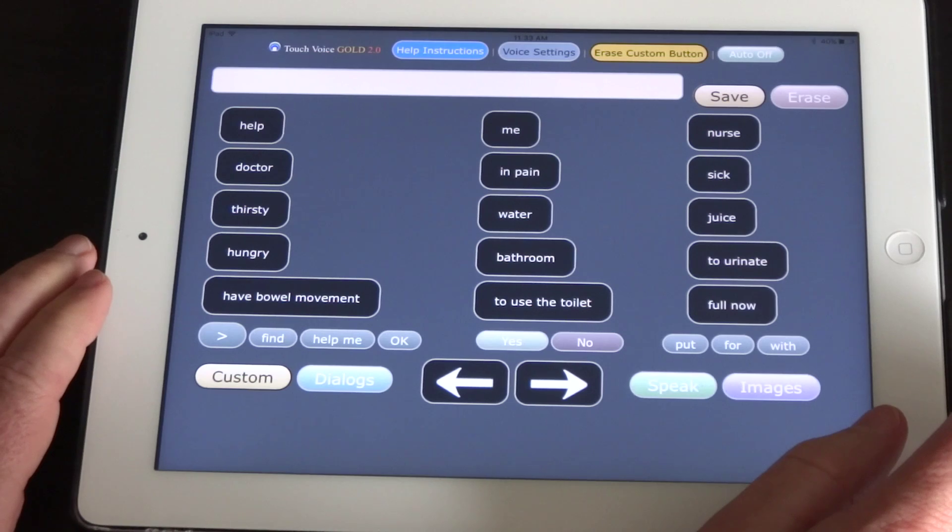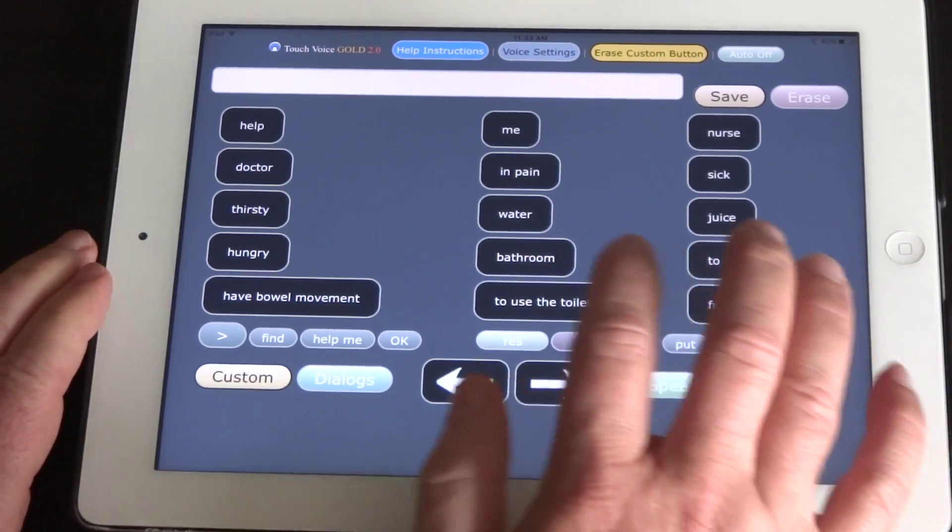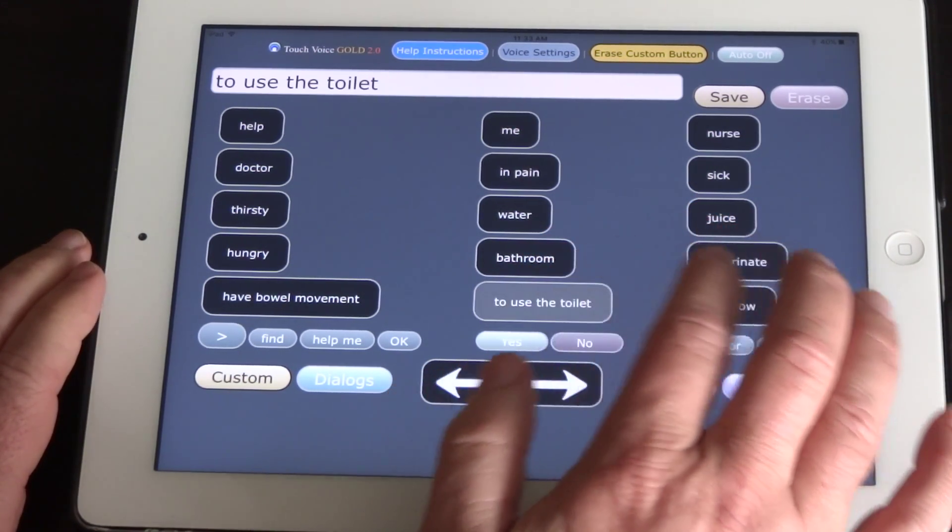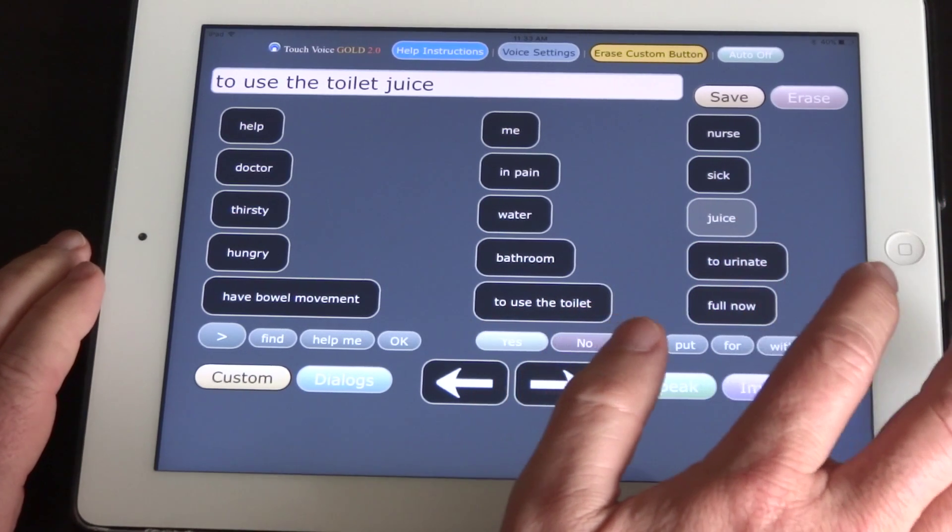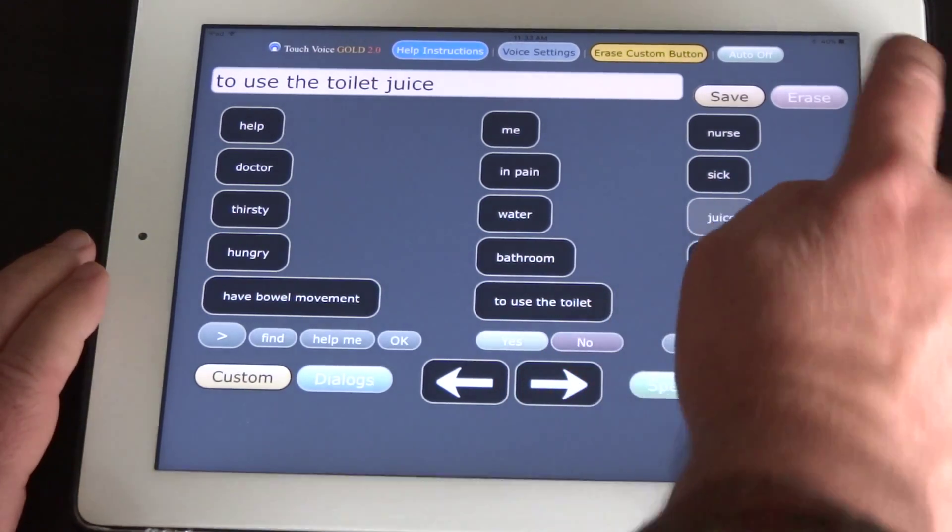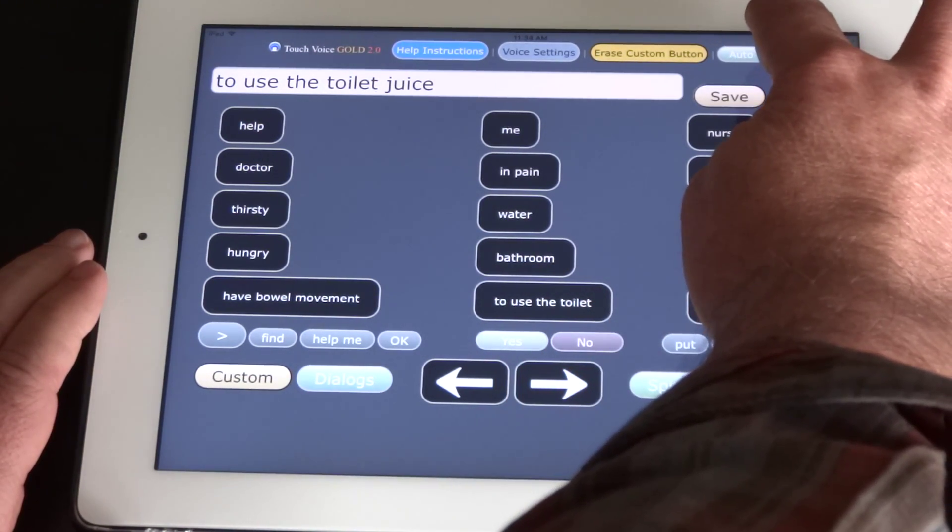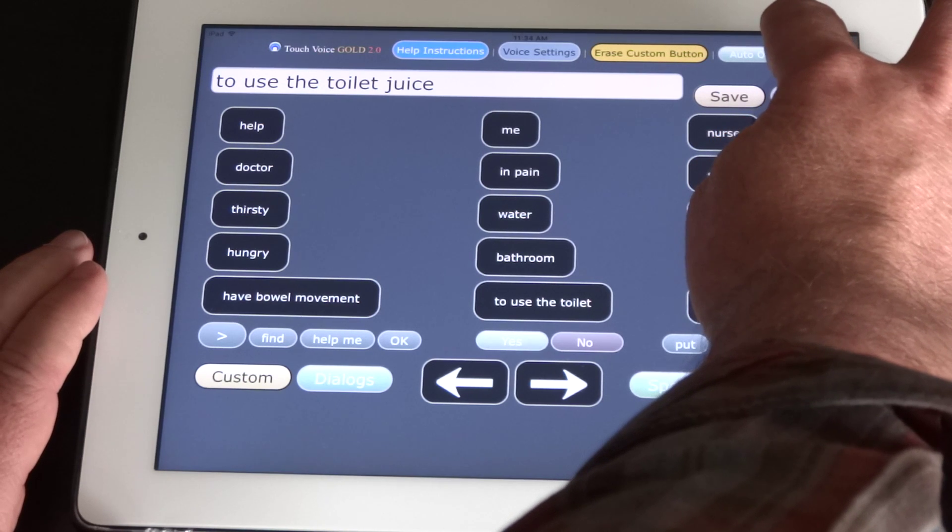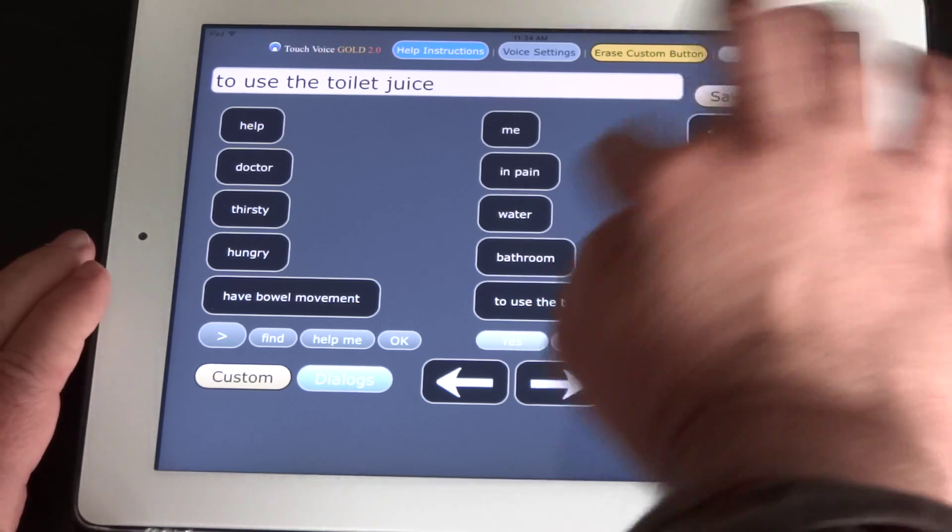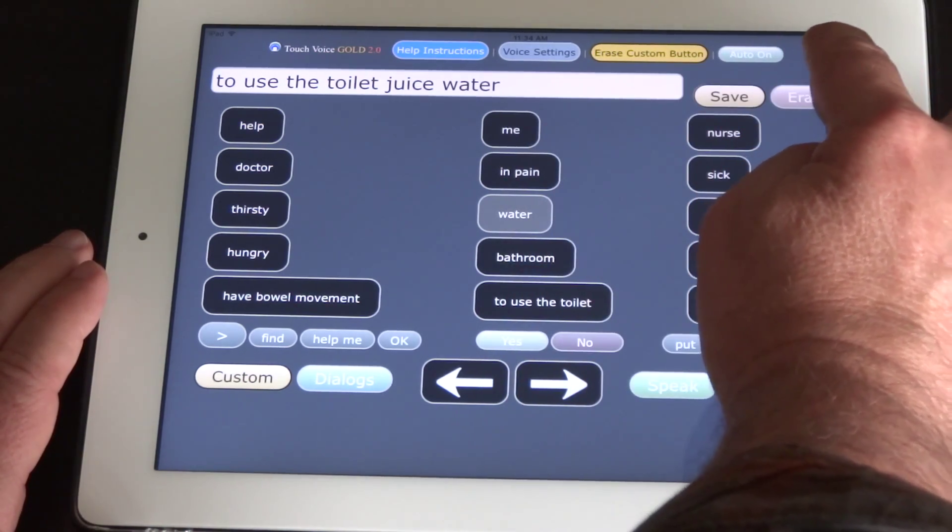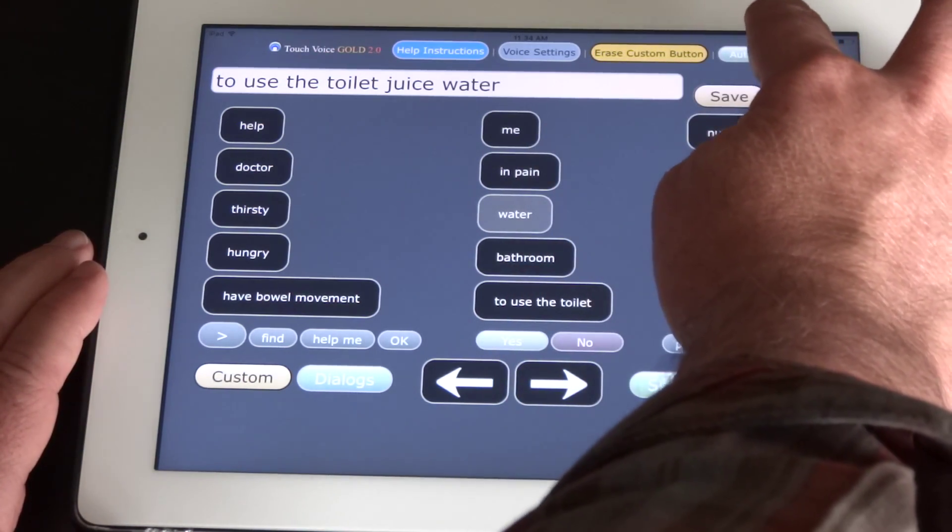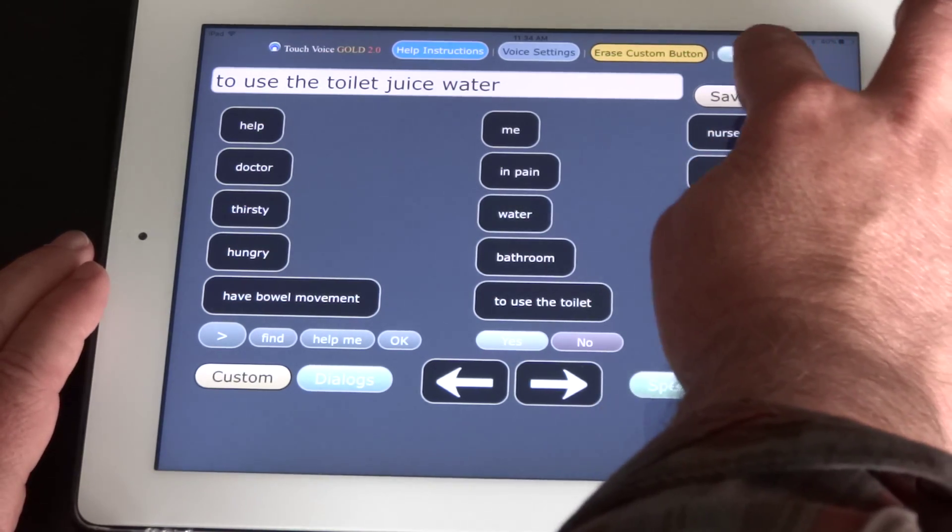When you come into the screen, you can press the black word phrase buttons to speak. You can turn the auto-speak on and off up here. If you have it on, it speaks immediately, and if you have it off, it doesn't.